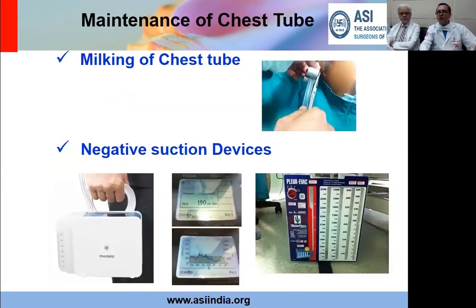Afterwards, milking of the chest tube. So if there is a lot of blood or something collecting, you have to keep emptying that. Now, we don't recommend suction devices routinely. I would only recommend that you connect the chest tube to an underwater drainage bottle and have the fluid draining. But sometimes if the lung does not expand, there could be, in specific situations, a role for a negative suction device.